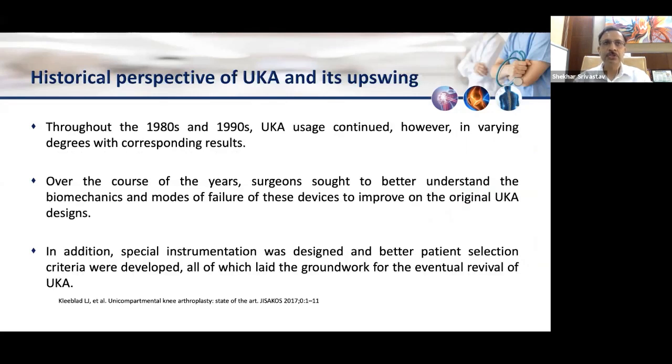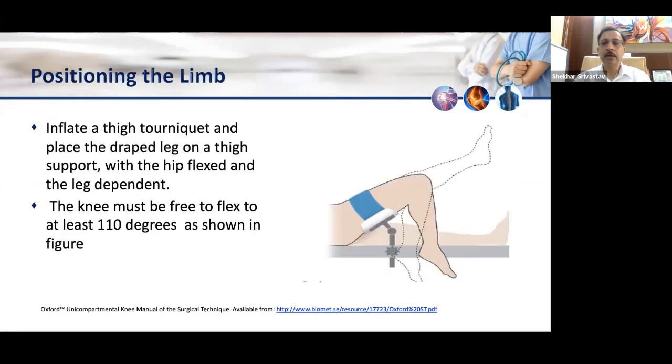But then there were changes in the implant design and in the techniques, and over the years surgeons have understood the biomechanics of the knee in a better way. So with better instrumentation and better implants, the results of UKR are now much better.